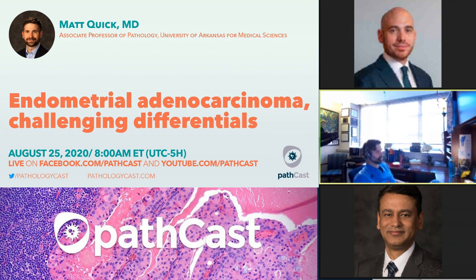Now, it's not necessarily a Lynch syndrome patient, right? Because that is usually due to promoter hypermethylation in the setting of endometrial cancer. So you would need further studies to make sure that they don't have Lynch syndrome. But yes, if I see MLH1 loss, that's a pretty good sign that you're dealing with an MMRD tumor.